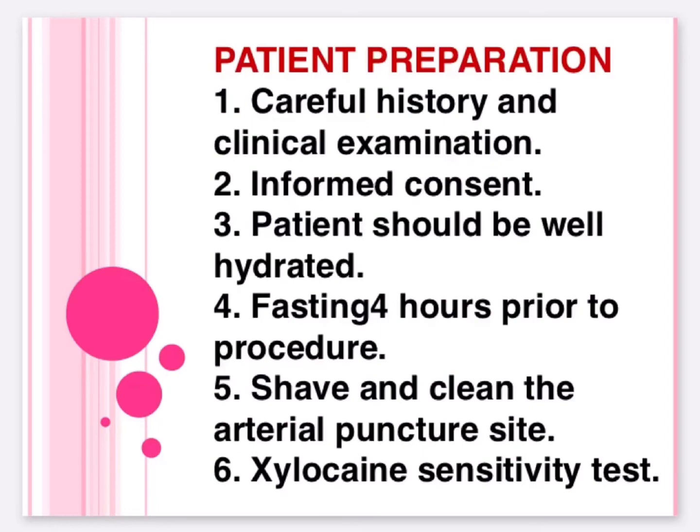Patient preparation. 1. Careful history and clinical examination. 2. Informed consent. 3. Patient should be well hydrated. 4. Fasting for some hours prior to procedure. 5. Shave and clean the arterial puncture site. 6. Xylocaine sensitivity test.